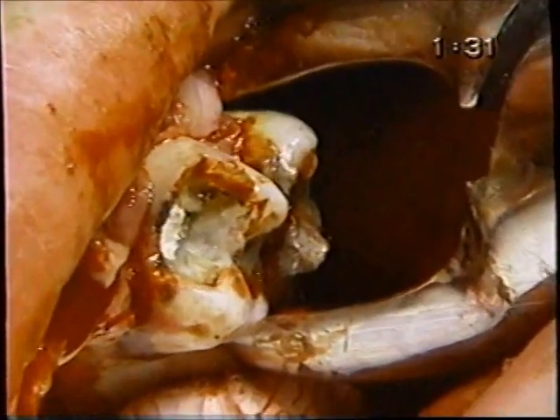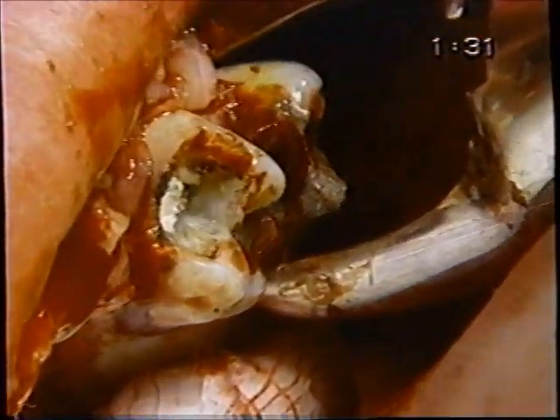The problem here is I think there's divergent roots. So we're okay. Two more.